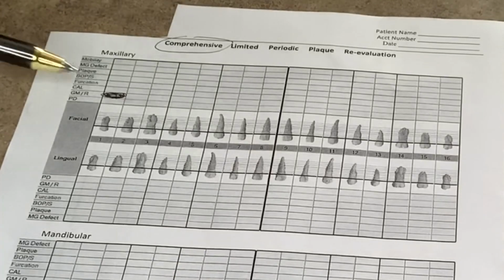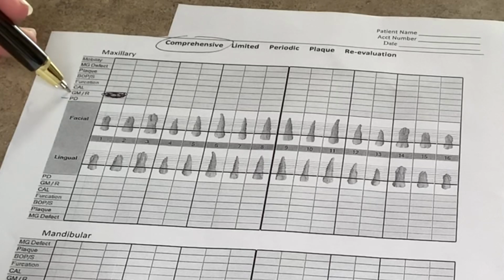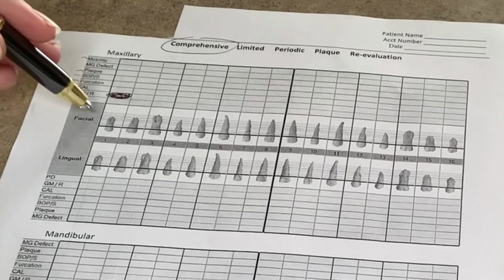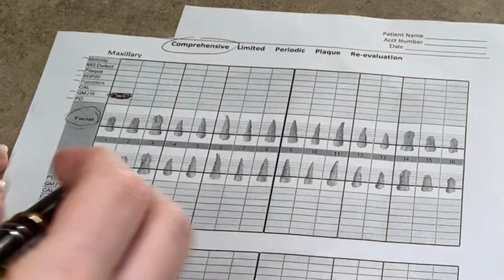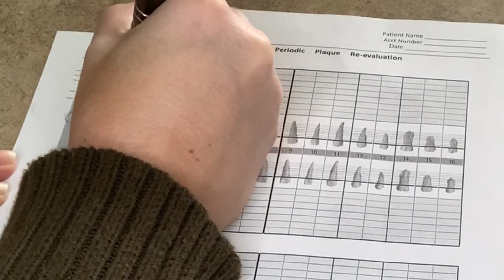All right, so here is that piece of paper. At the top of this piece of paper, those are just a different type of exams that your hygienist or doctor will be doing. So I just circled comprehensive, which means a new patient exam, a full exam. And on the sides, those are what we talked about. Just the perio depth, the gum recession, furcations. And then of course you have your facial and lingual on the top and the bottom. And don't mind that little thing cut out on top. That's just the office that I work at. So I took that off the piece of paper.